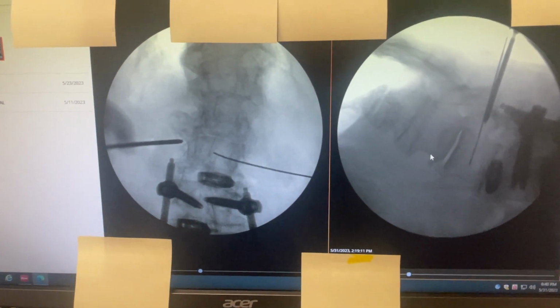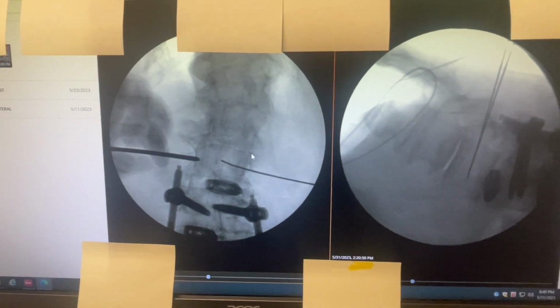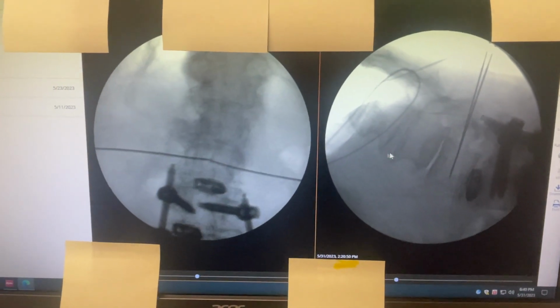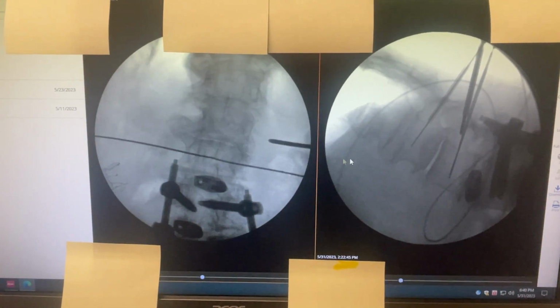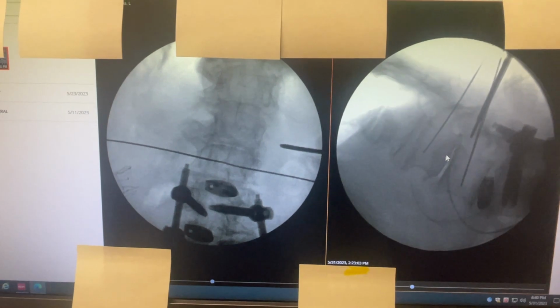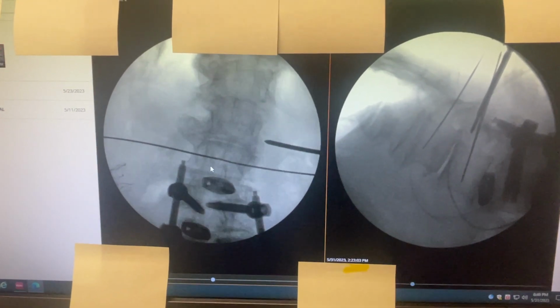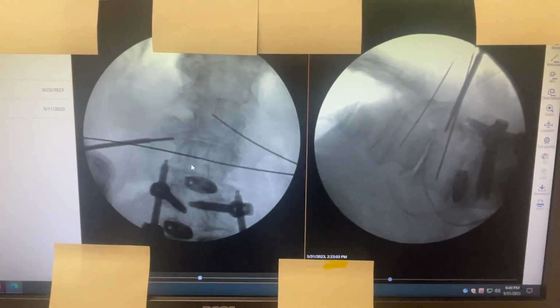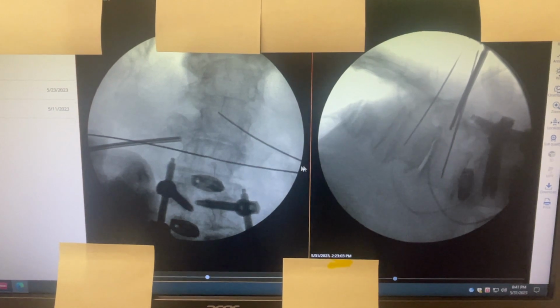Now, this is now important. Since 2015, I have been doing prone laterals, and I use the same instrumentation. Patient is obviously prone. I first tried to get to the Kambin triangle here, but you see with this large osteophyte here, it's really not possible. So I do a prone lateral, or what we call MIS-DLIF. Our paper has been published in 2017.